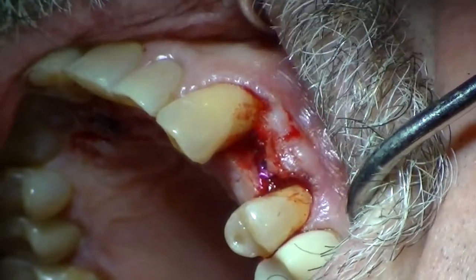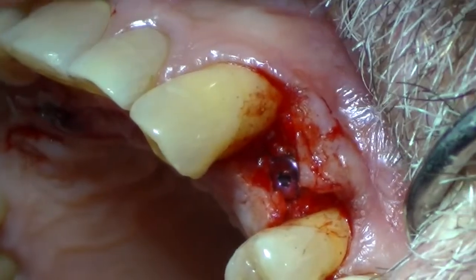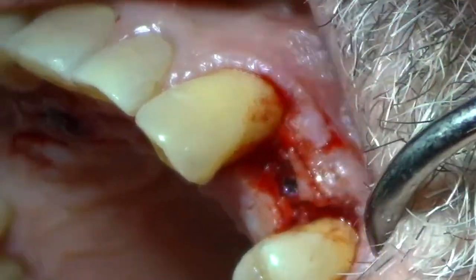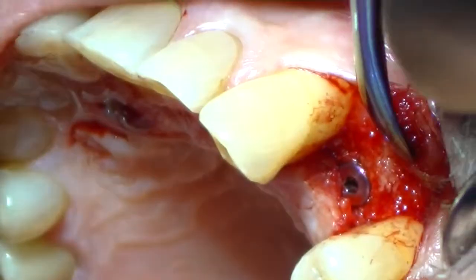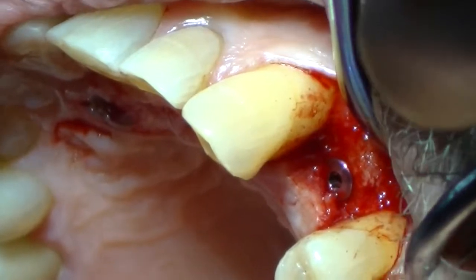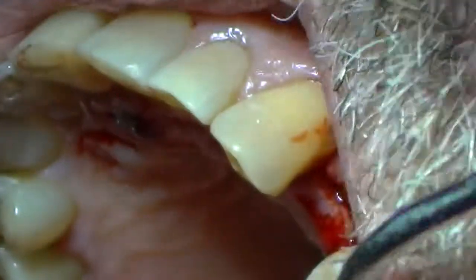Now you will be doing radiographic evaluation of this site, but we can certainly see that we have a good amount of facial plate of bone, and we should get an excellent situation. So we'll suture this area quickly.